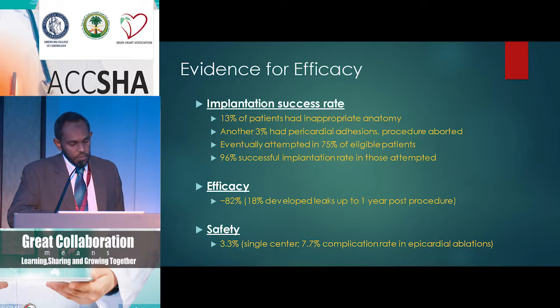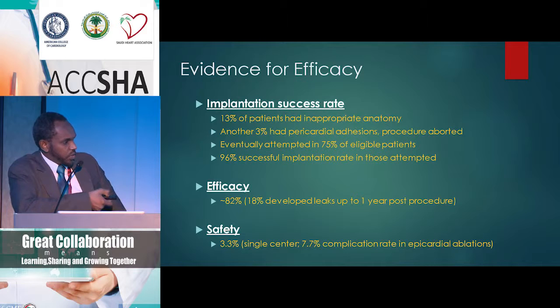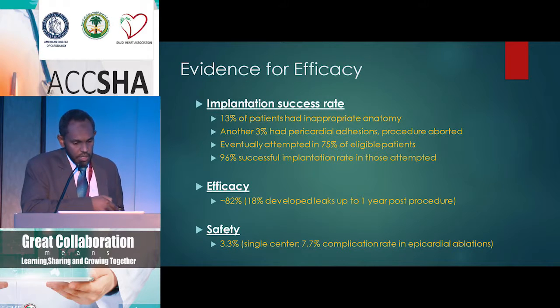There's really a paucity of evidence here on this device: a 3% complication rate, but this is from a single center, probably a center with a high rate of patients undergoing epicardial ablations, probably operator proficiency. Comparing it to complication rates in epicardial ablations, which are 7.7%, 3.3% means a highly proficient center. I don't believe this number. So basically, this is a skewed number and should not be relied on.